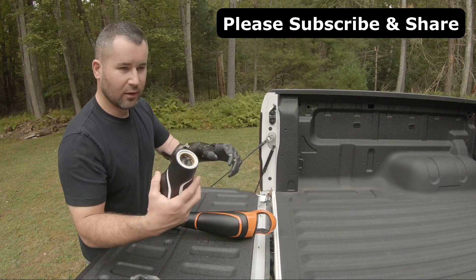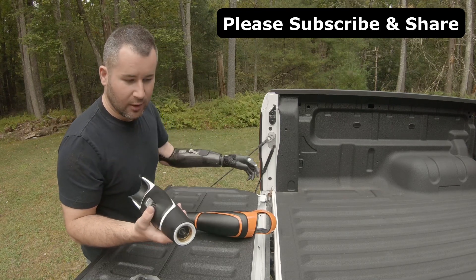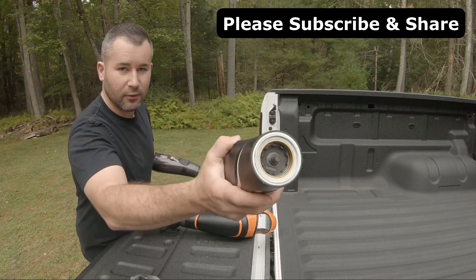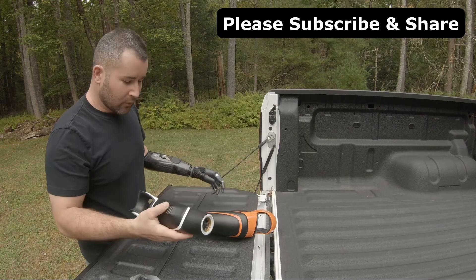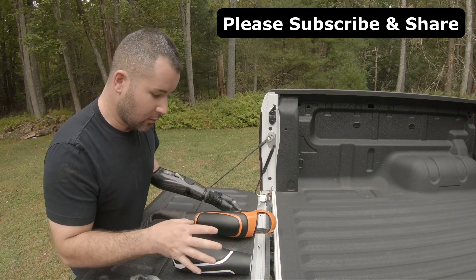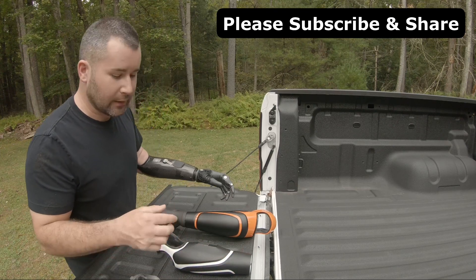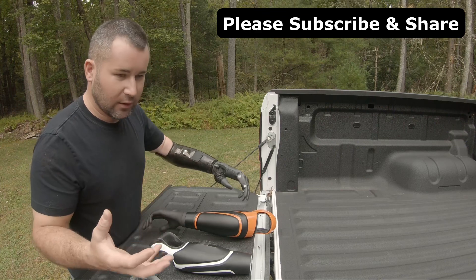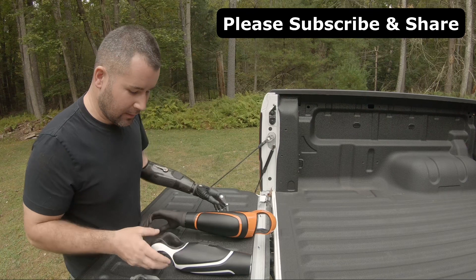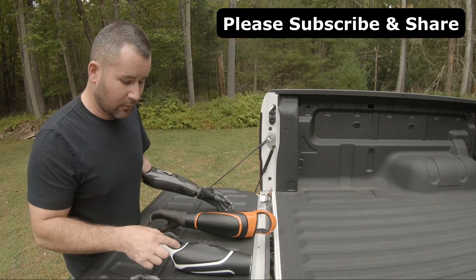You can put TASKA, i-Limbs, Bebionics, Covvi hands, etc. — they'll go right on here just like any other hand. How the process goes is you go to your normal prosthetist's office, they fit you, measure you, do the fittings with the plaster and all that, and they send the mold and the measurements to Glaze.